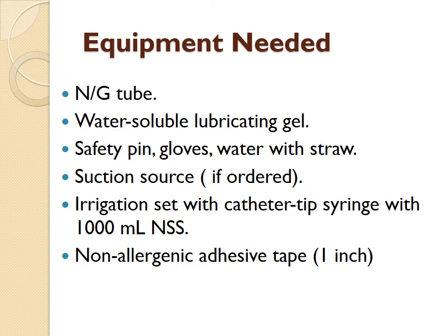You will need non-allergenic tape, at least an inch wide, or pre-manufactured nasogastric tube holders, depending upon your facility's policy. I know you're tired of hearing me say that, but you always, always, always must check the policy and procedure manual of your facility.